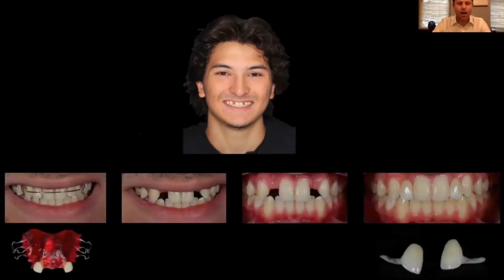At this point, he was 16 years old, wasn't ready for implants. His orthodontics had been finished. He had a retainer with 2 false teeth in the front. Eventually, he was tired of having the metal wire. So then we made Maryland bridges on the anterior, which could have been final restorations, but both him and his family really wanted to get the implants done once he turned 18.